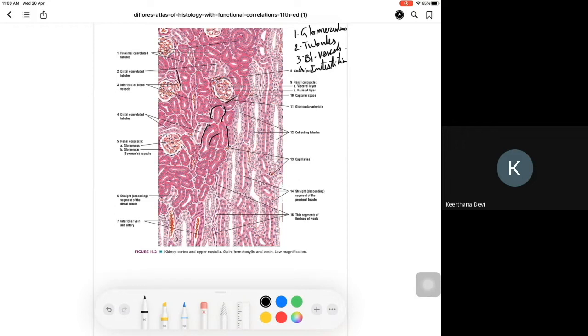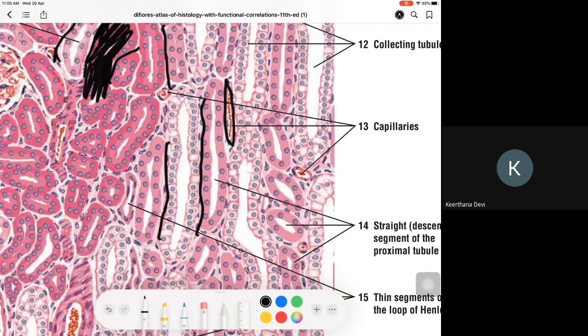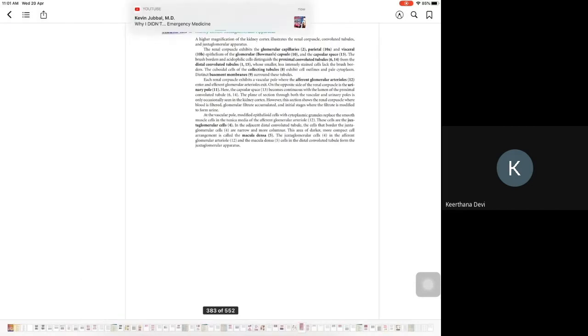These are all the interstitium. Normally, you don't see it. For example, in tubular atrophy, the tubules undergo atrophy, and then you start seeing the interstitium. The blood vessels and interstitium, this is a nice strip of interstitium. We will concentrate on the glomerulus.